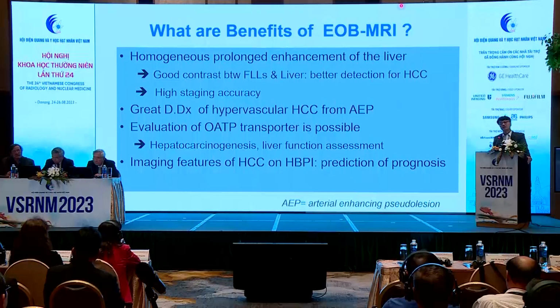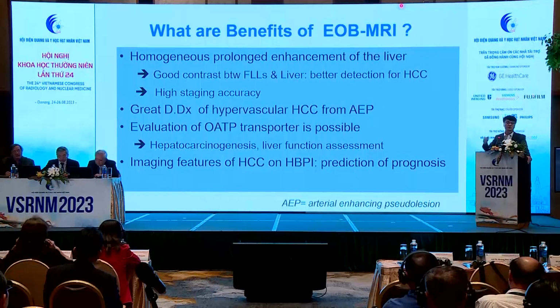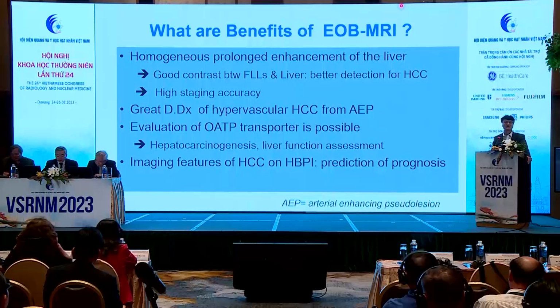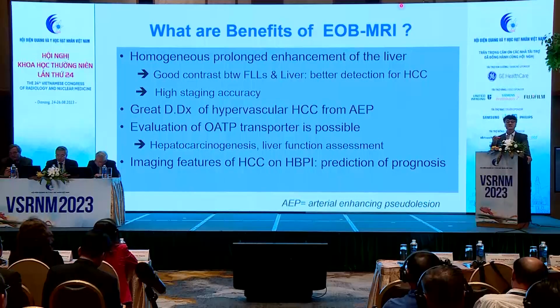Furthermore, in cirrhotic liver, one of the common false positive lesions would be AP shunts. As liver fibrosis increases the post-sinusoidal pressure, the portal blood flow cannot enter into the sinusoid. Therefore, arterial hyperperfusion occurs, and then AP shunts are commonly shown. And those lesions show arterial hyperenhancement. Therefore, they can mimic HCC. But with EOB, the hepatocytes in the AP shunt region may possess well-functioning OATP transporters.